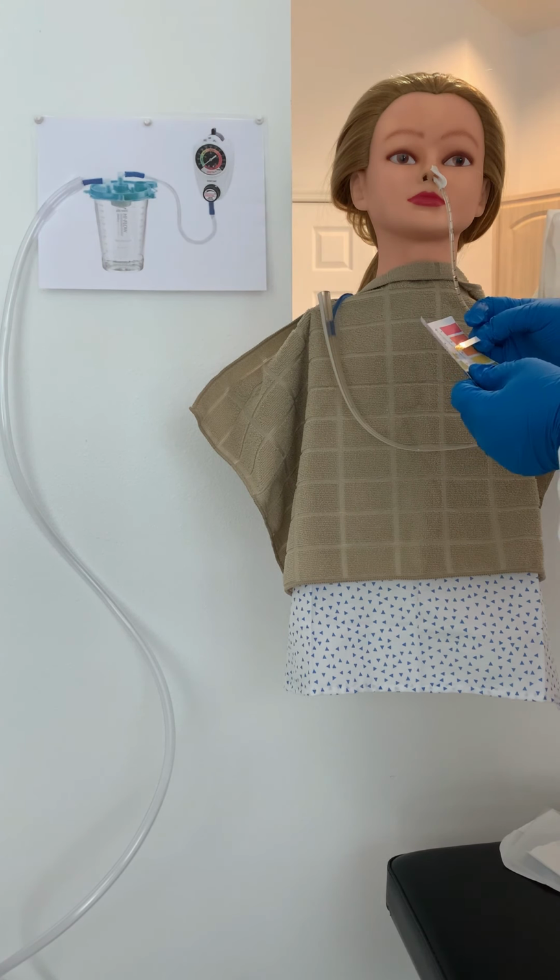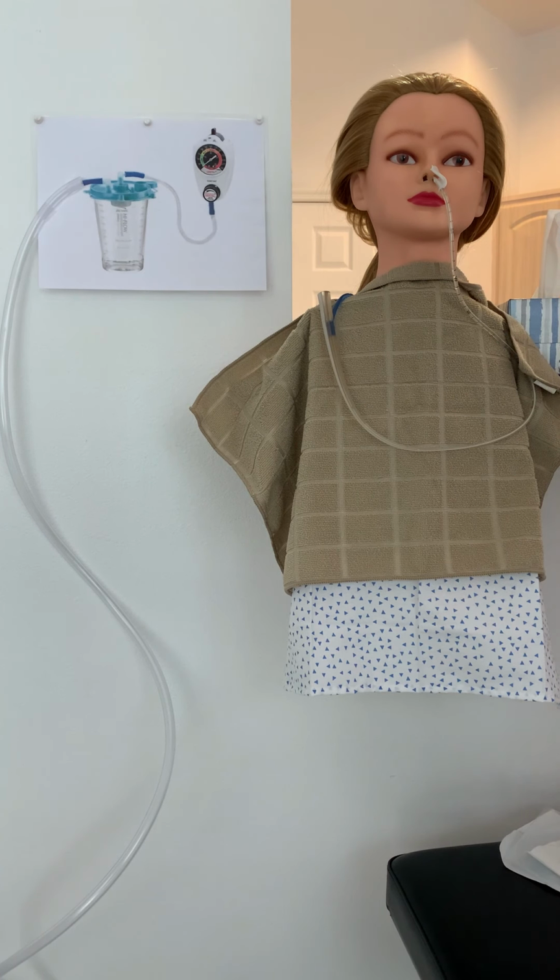So it looks like it is a 4, which is good. Less than 5 means we're in the stomach. So we are safe to assume we're in the right place. We would also obtain an X-ray to verify, depending on our facility's policies.